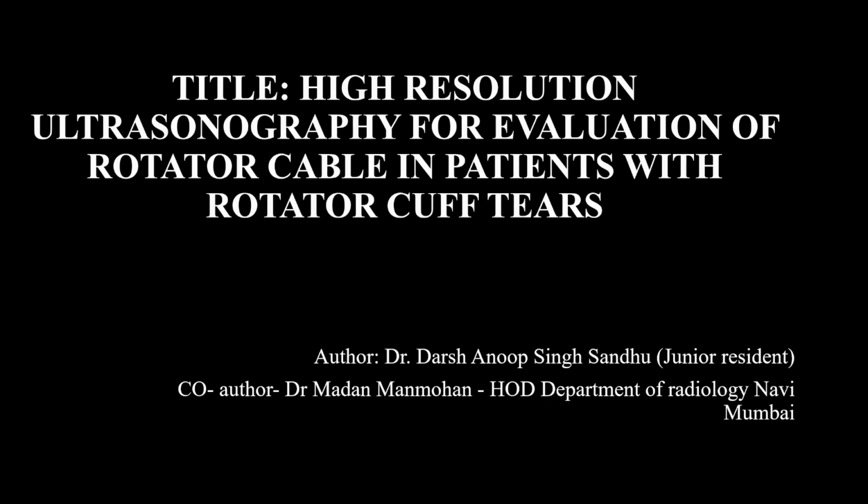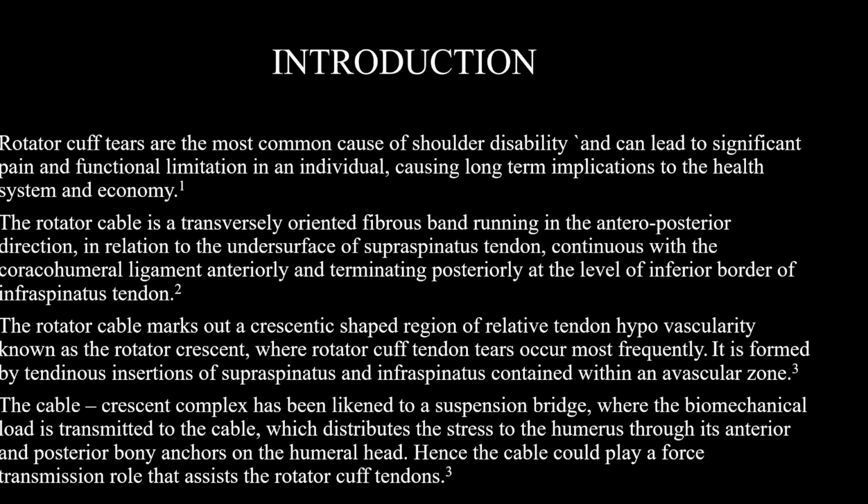Hello, this is Dr. Darsh Anoop Singh Sandhu, and I'm going to present my paper on high resolution ultrasonography for evaluation of rotator cable in patients with rotator cuff tears. So, rotator cuff tears are the most common cause of shoulder disability and can lead to significant pain and functional limitation in an individual, causing long-term implications to the health system and economy.